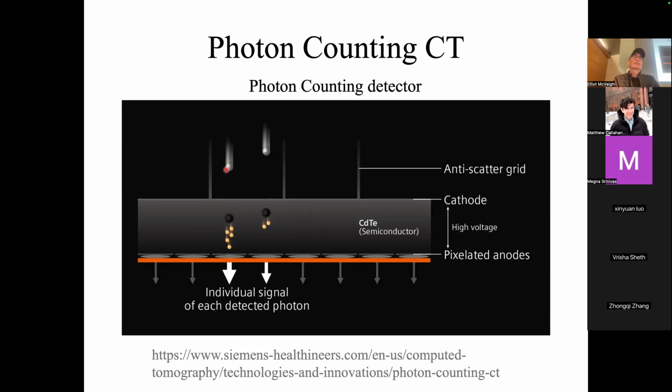If we go more sophisticated and we say, okay, now we're above a threshold, what is the relative height of the peaks above the threshold? It turns out the height of that peak is pretty well linearly proportional to the energy of the incident photon. So now we can divide up our detection such that I'll have 4 buckets: low, low-mid, mid-high, and high energy.